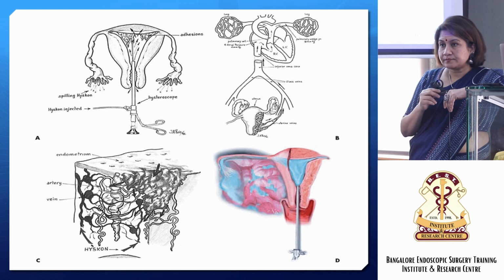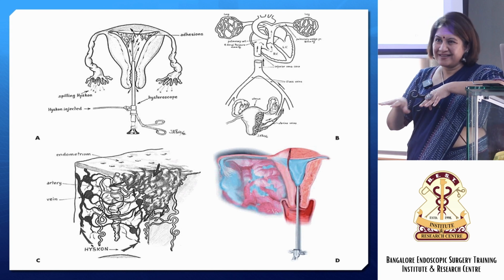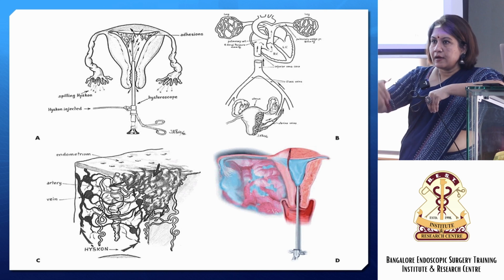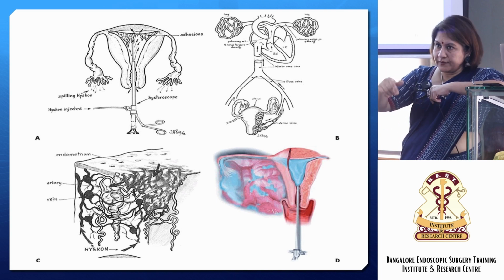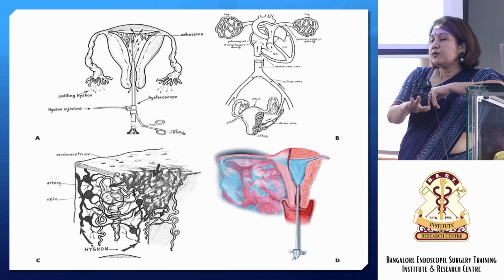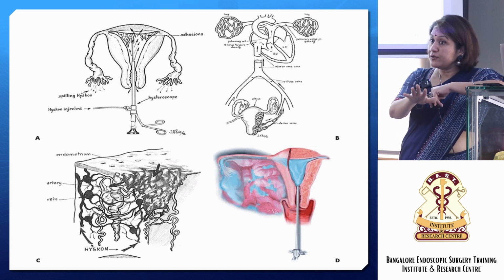Calculate the deficit. In lithotomy position, you cover with an under-drape that will absorb some, so you'll have to give that much margin, because the whole plastic goes under the buttock. If you have an outlet, either some people connect it to the suction, but I don't do that. I put the outlet into the bag itself. Otherwise, you can connect to the suction.